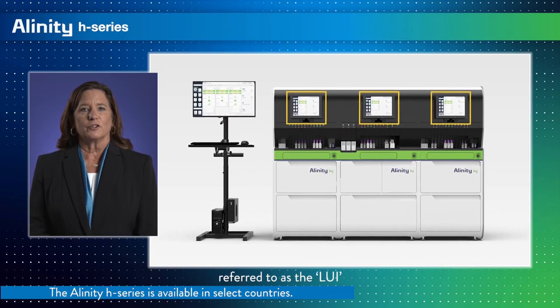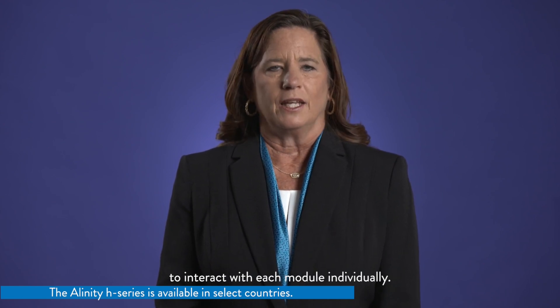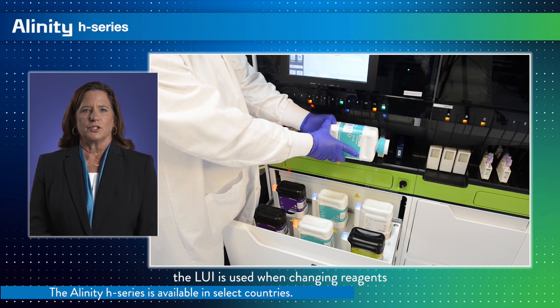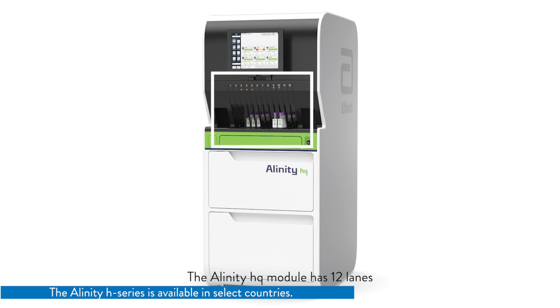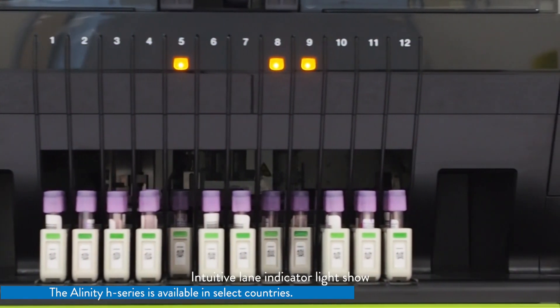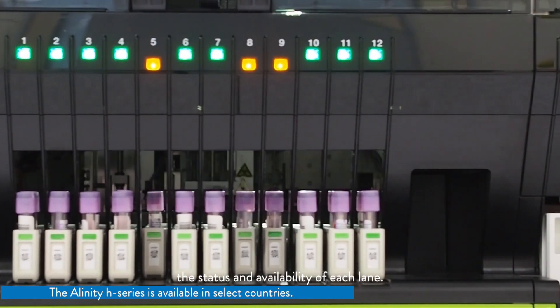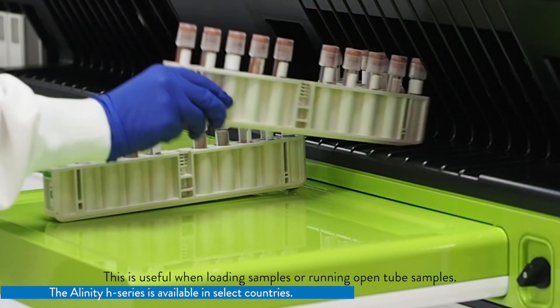A local user interface, referred to as the LUI, is on the front cover of each module. It is like a small tablet with a touch screen that allows the user to interact with each module individually. With the built-in barcode reader, the LUI is used when changing reagents and running open tube samples. Below the LUI is the sample loading area on each module. The Alinity HQ module has 12 lanes, designed with a total load-up capacity of 120 samples per module, while the Alinity HS module is designed with 8 lanes. Intuitive lane indicator lights show the status and availability of each lane. A retractable shelf provides a workspace for the user without increasing the analyzer's footprint, useful when loading samples or running open tube samples.